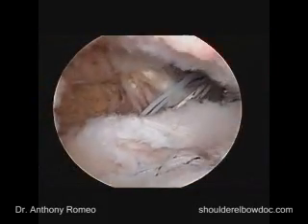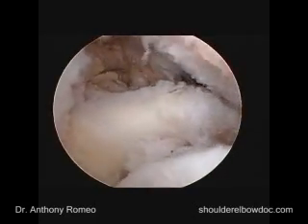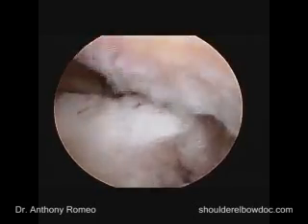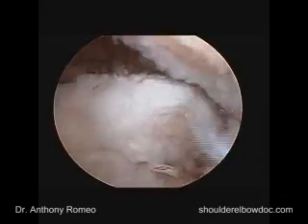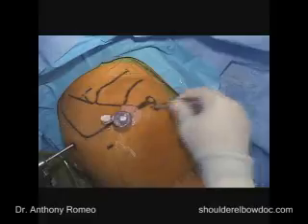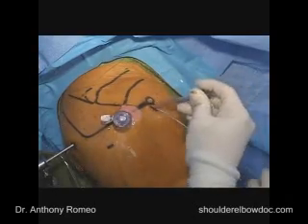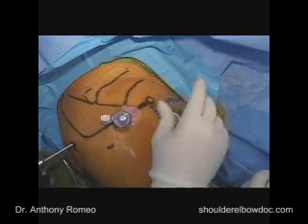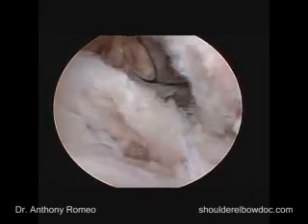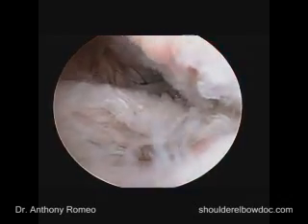That's our first anchor. If we pull on our sutures, you can see what's happening — this is going back into the position that we wanted to, but it's the lower part of the repair. Although it's looking nice, we still need to get that upper rolled edge into place. So we'll take our sutures out of this anterior cannula, and put a hemostat on that so we don't get confused and grab the wrong stitch. Then we'll get ready to put our second and final anchor in for the subscapularis repair.